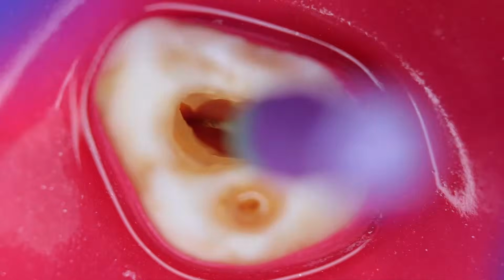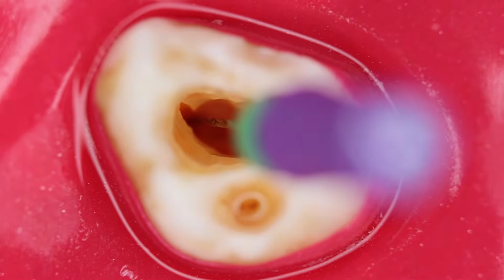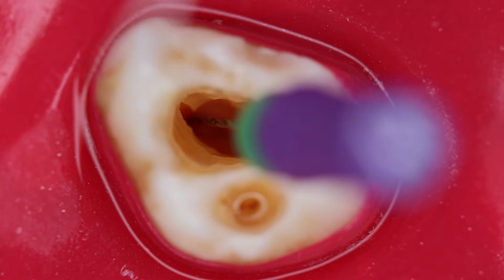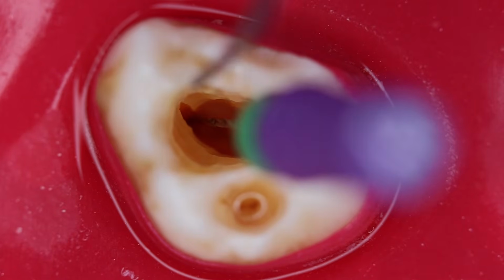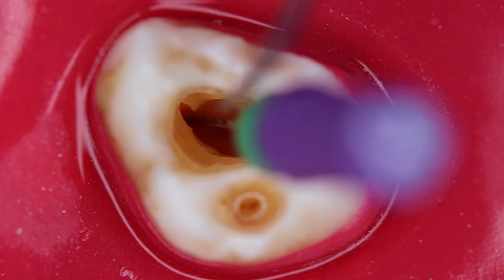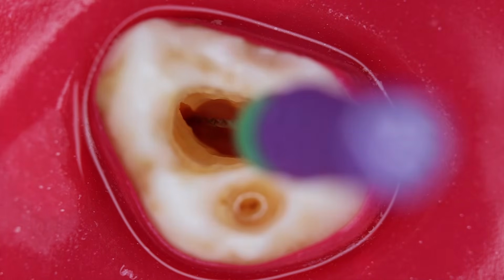So this is going right beneath the mesiobuccal cusp over here. So these are the minimum canals that you can find. Try to look for more canals, that is the second and third mesiobuccal canals. So the minimum number of canals has been looked for.